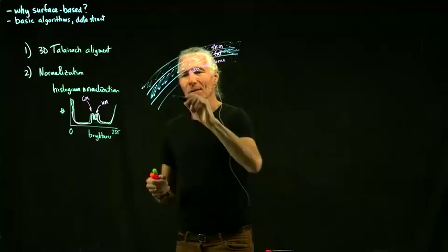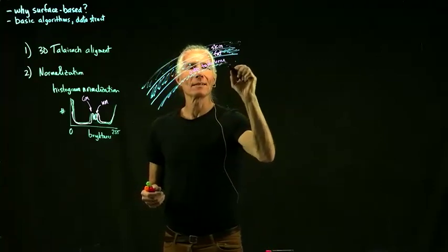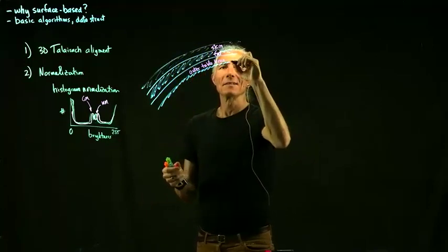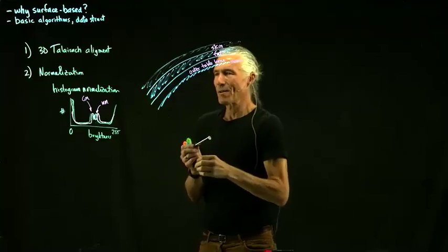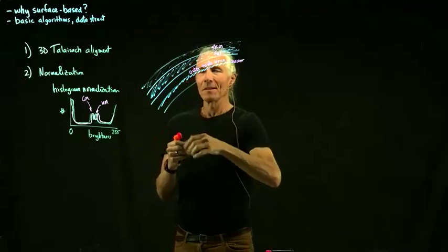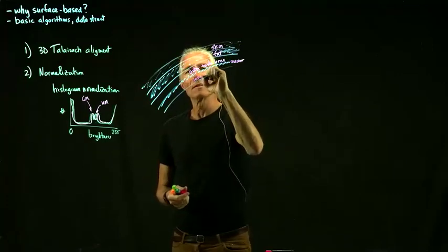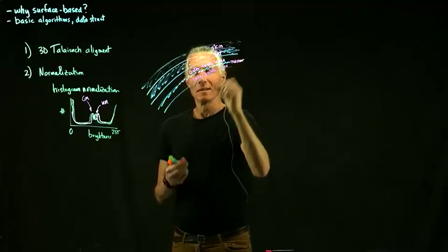So there's another light layer. That's all the blood vessels inside the skull, so we'll call that the marrow. And then you have the inner table of bone. So then there's another black layer, the inner table of bone.